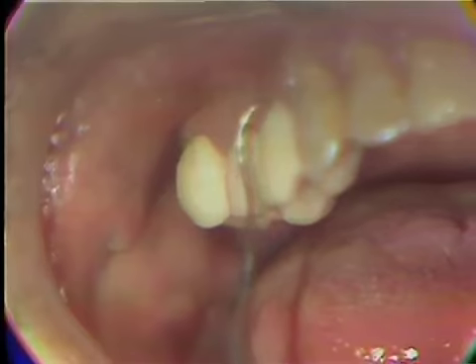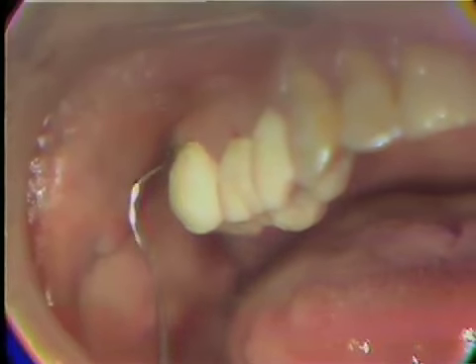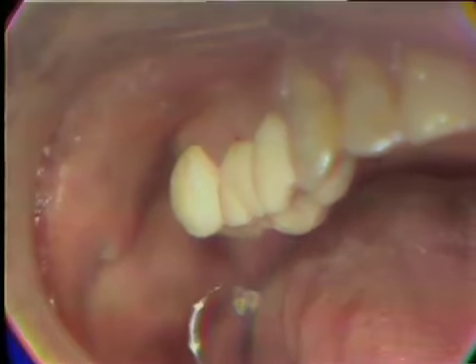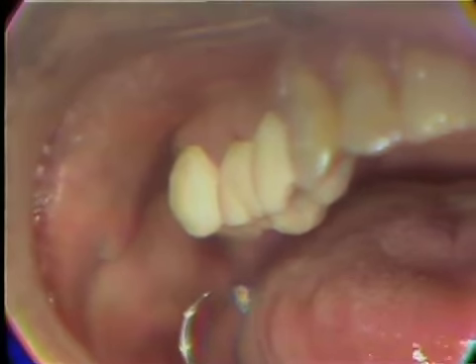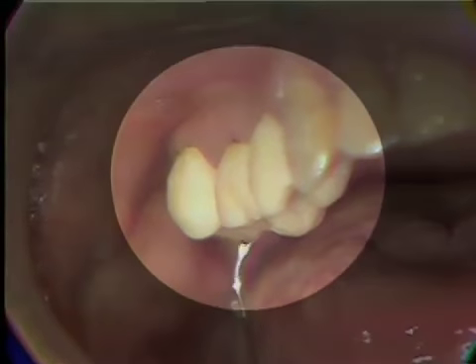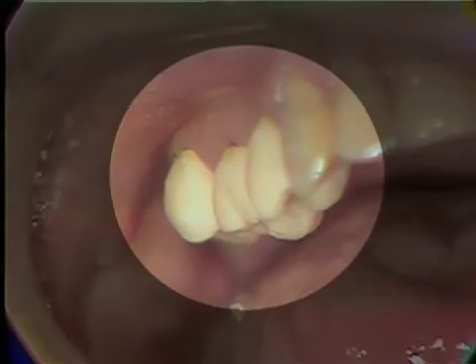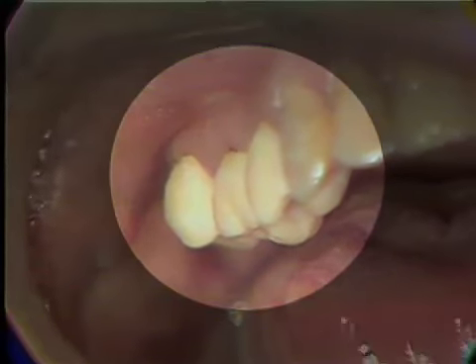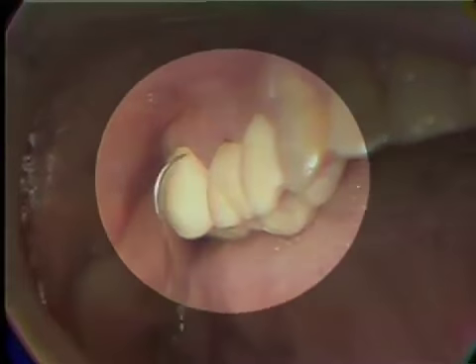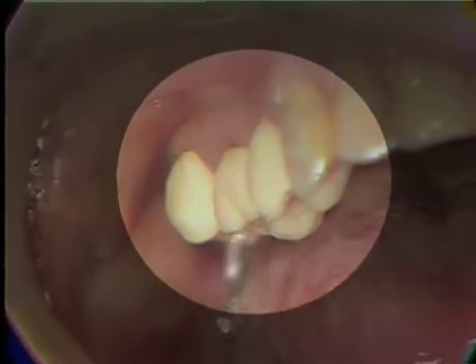We would like the margins to be adapted as close as we can to the margins of our preparation. If the margins are underextended, they could cause a sensitive tooth, or more important, they would allow the tissue to grow into that area. Then when it comes to the time of putting the final restoration in, the tissue would have to be pushed back again to get it out of the way. So the margins are important to keep the tissue in a healthy state and also keep the tissue in the position that you would like to have it.